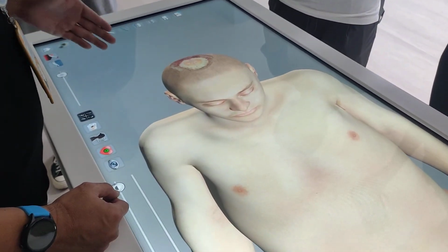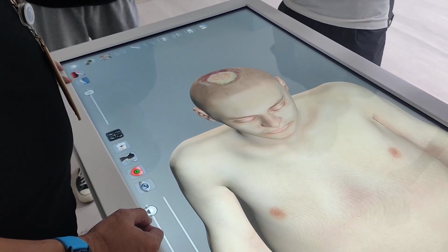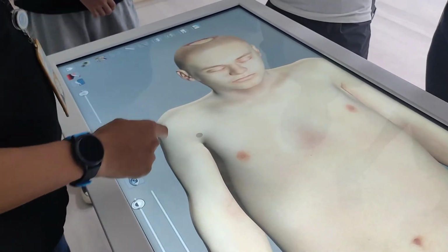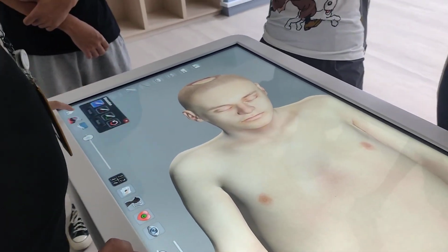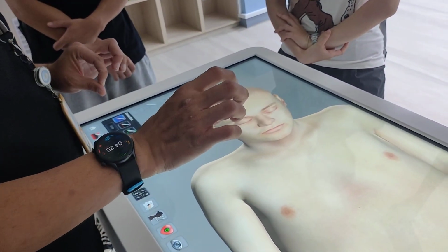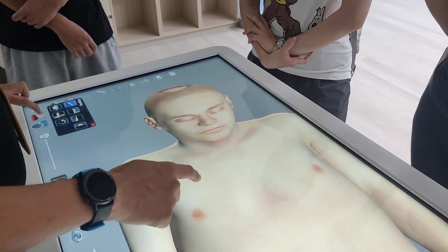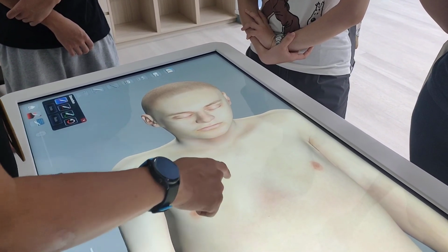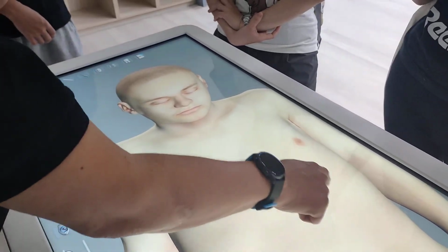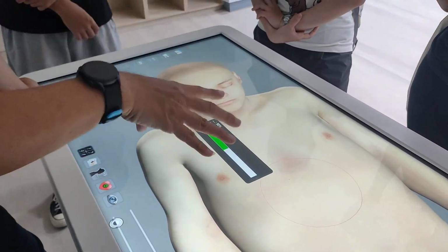你可以用刀子去切它。And this one, so these two are basically different. This is to chop all of the plane, but this one you can, I would say, take out the tissue layer by layer. Okay? For example, if I do a circle here, then I touch this, it basically removes the skin.